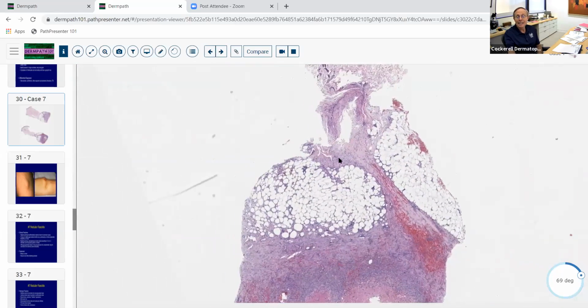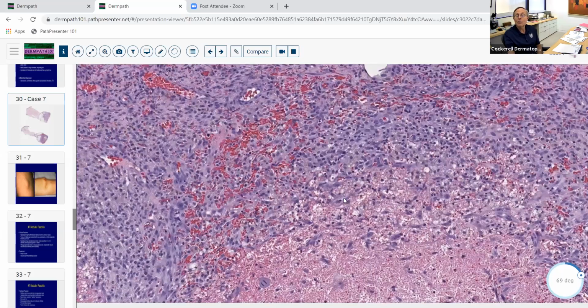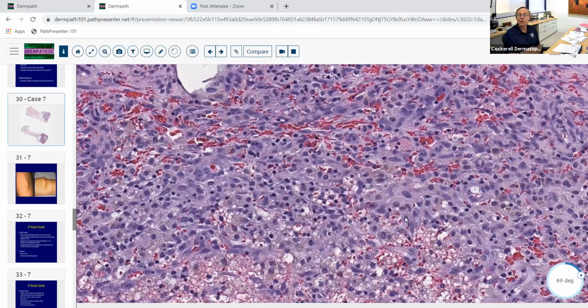So this is not a neoplastic process. It's really almost analogous to a dermatofibroma that's just basically occurring in the fascia. So this is an inflammatory disorder that's induced by trauma most commonly. When kids bump their head, for example, they get that swollen nodule on their forehead. If you actually go in and biopsy that after a couple of days, you'll often see features of nodular fasciitis.